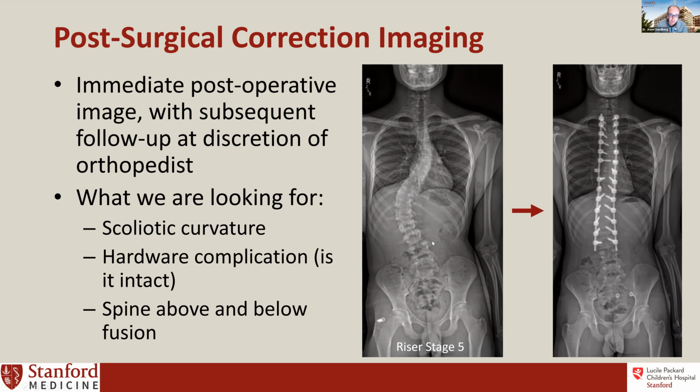Like in this example here, if you want to measure this Cobb angle, I would say that vertebral body has the biggest bend, it's where the curve maximally bends. And this vertebral body here is the maximal bend up. So I'll measure from there to there. In six months, if that doesn't make my largest curvature, then I won't use that vertebral body. It's many things. You are correct. That's a good question. In many things in radiology, we do want to measure the exact same things when we're comparing, like lesions and kidneys.